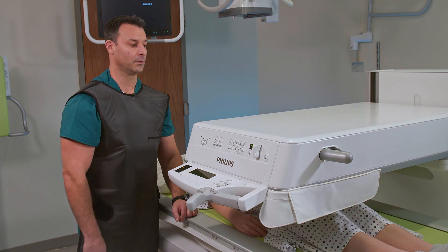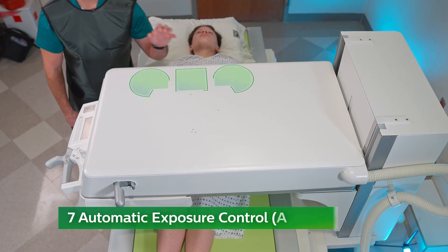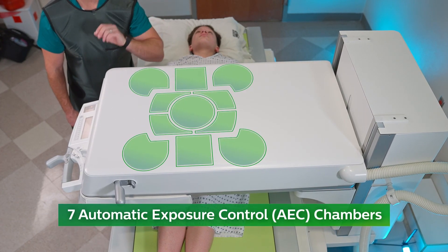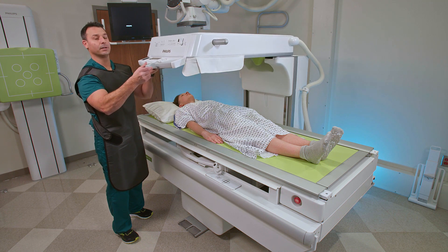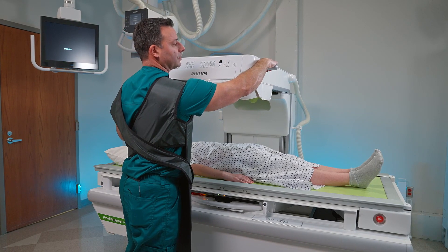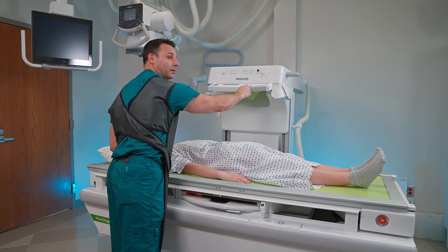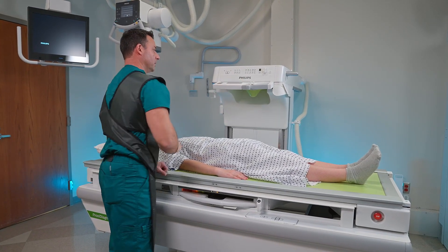With our new flat detector, we have seven AEC chambers — three on the top, one large one in the middle, and three on the bottom of the detector. I'm going to bring this up and park the tower now. To park it, you simply grab the handle, move it back to park your tower, and lock it into position.